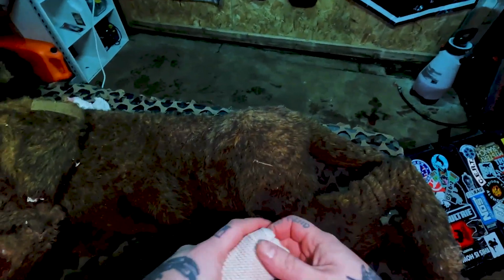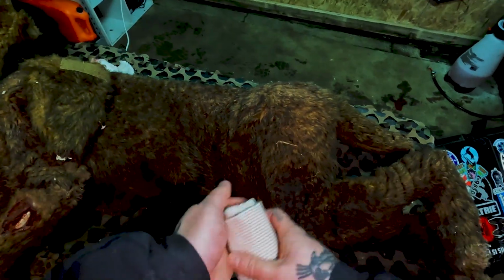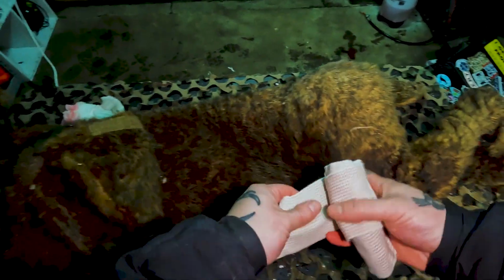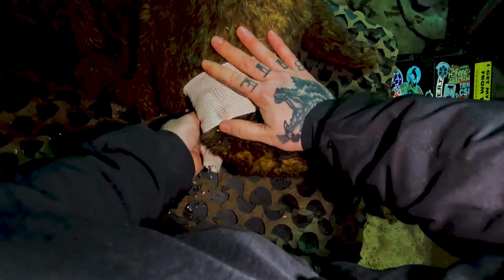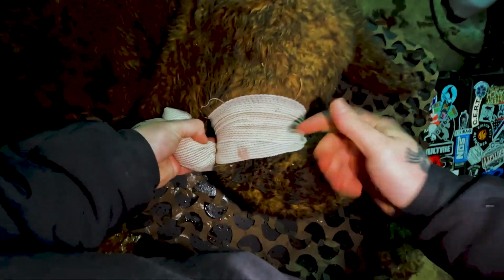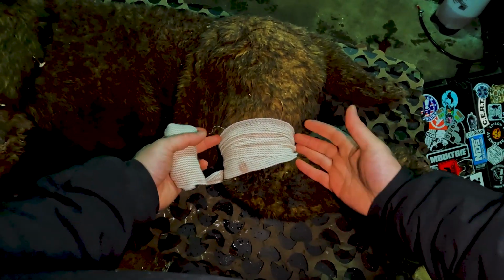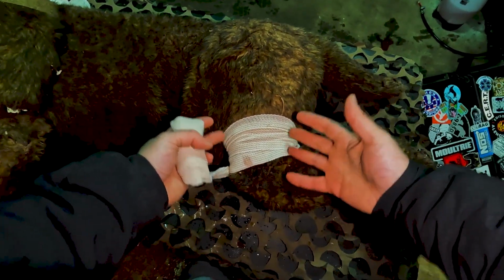One last thing about bandaging canine extremities. I think someone had asked, if you are bandaging up higher on the leg and you don't want it to slip down, you can use over the back or over the shoulder to anchor that bandage. Like let's say there was an injury here, we were bandaging. You can see this is the reason why a lot of windlass tourniquets like CAT and SWAT-Ts don't work so well, especially on dogs' rear legs. It's the conformity of the leg lends everything to slide down it.